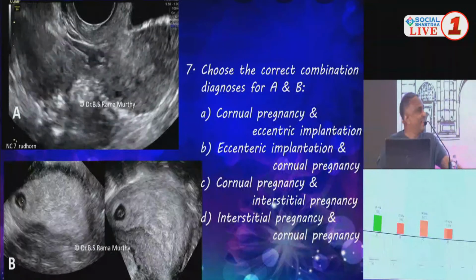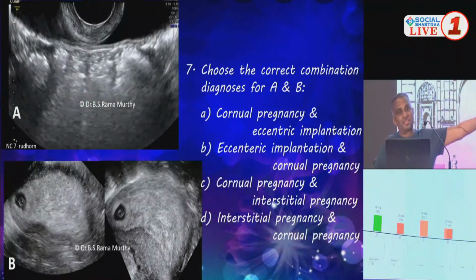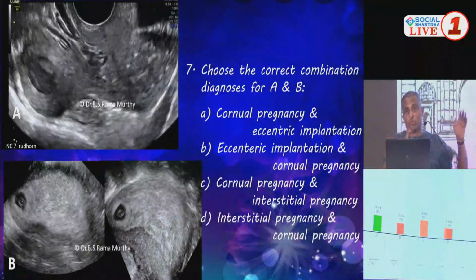I've got A right. But I thought more of us would get this right because I thought it was fairly simple. Now, the confusion is nomenclature. We all know what we are dealing with.